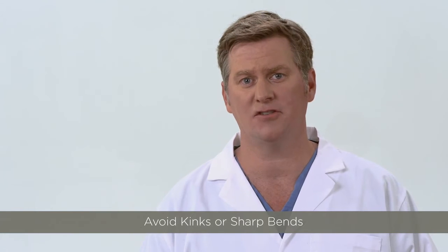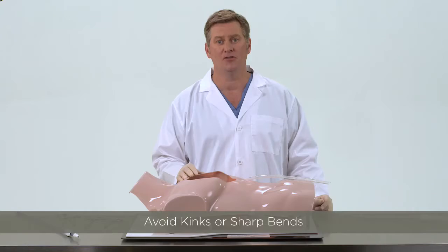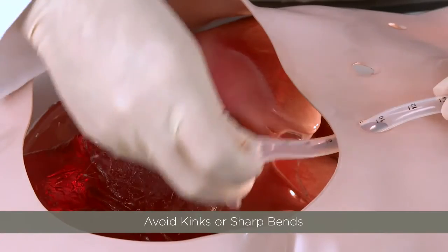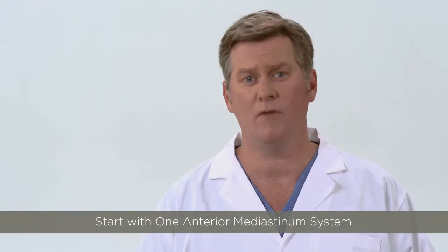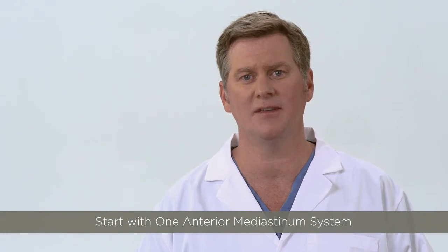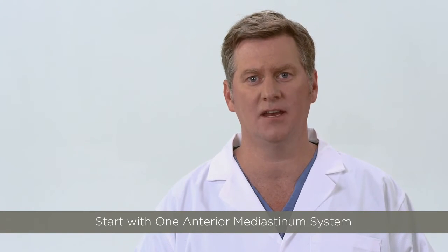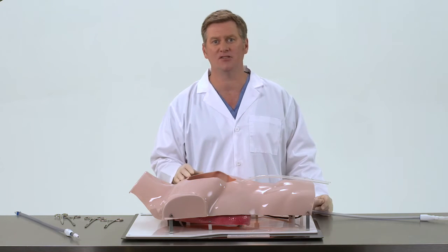The path of the chest tube inside the chest is also important for the PleuraFlow system. The surgeon places the chest tube in the usual fashion. However, it is imperative to avoid any kinks or sharp bends that will impair the travel of the clearance loop in and out. We recommend in the initial phases of implementation only one PleuraFlow system in the anterior mediastinum until the team is comfortable with the routine of this new device in their practice. The surgeon should place additional conventional chest tubes as required.